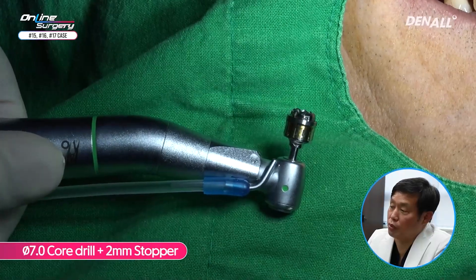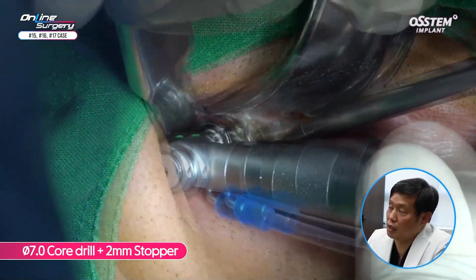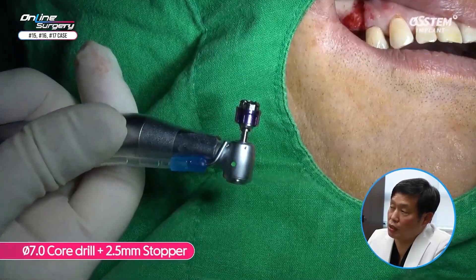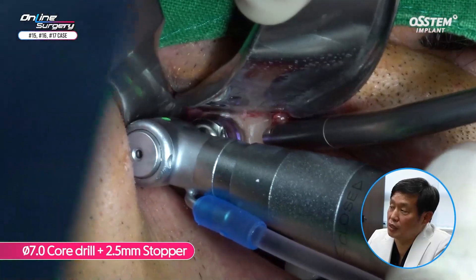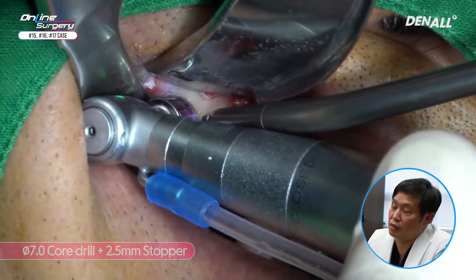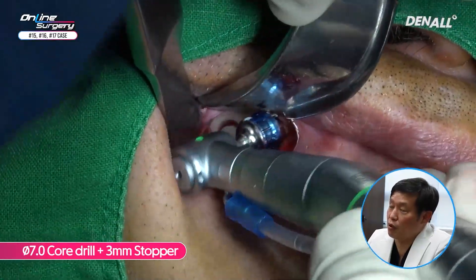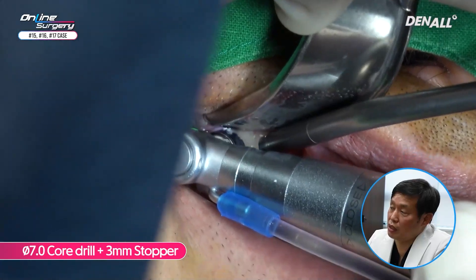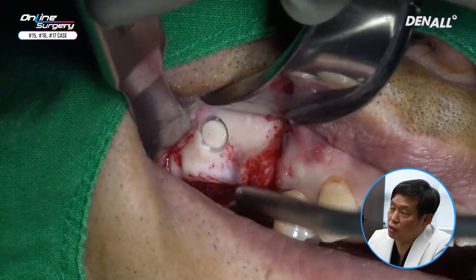The lateral wall is slightly thick and because of the curvature it looks thicker than expected. A 2 mm stopper is connected. Looking at the tendency of how the window is being formed, I don't think I will invade upon the blood vessel area. If you are in contact with the vessel there can be a bit of bleeding — don't be alarmed. After forming the window, stop the bleeding. If the vessel is fully within the bone, use a needle holder to apply compression. Stopping bleeding for intraosseous vessels can be done more easily. With the 3 mm stopper, I do not believe I have touched the vessel.